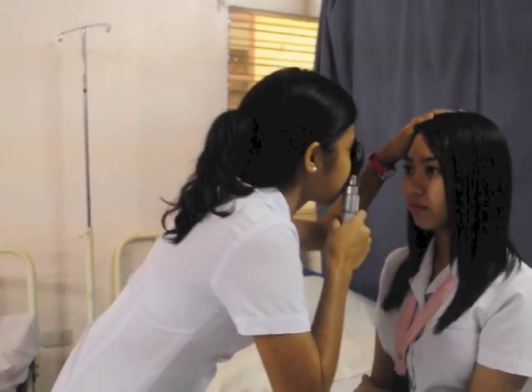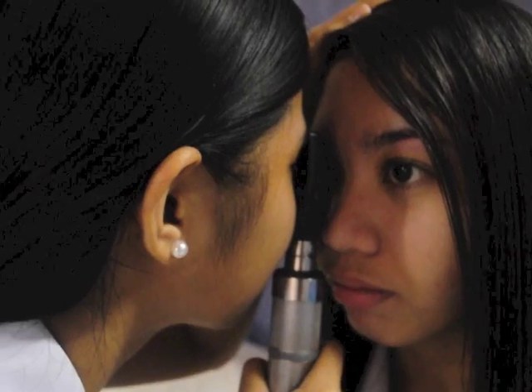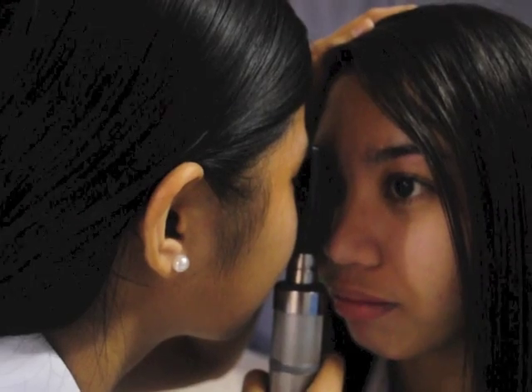To test for the optic disc, first move closer, within inches from the patient, turning the lens wheel to focus as needed. Identify the structures. The disc is located nasally; follow blood vessels to the disc and note color, borders, and shape. And also, test for the blood vessels and macula.